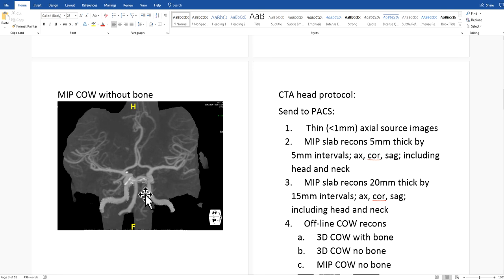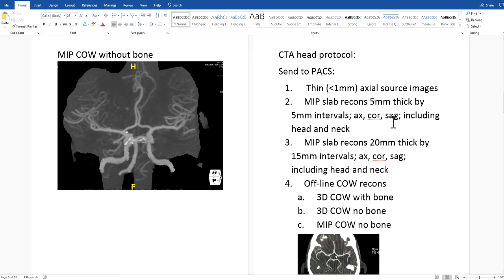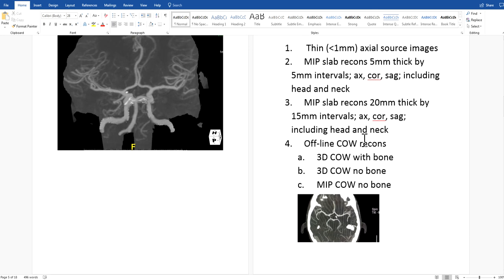We're really only talking in this video about how to make these offline COW recons. The whole CTA head protocol sent to PACS will have other information, including thin cuts less than 1mm axial source images, and then 5mm thick MIP slab reconstructions in 3 planes — axial, coronal, sagittal — including head and neck. We're also going to do 20mm thick slab MIP recons in 3 planes, and then we'll send our offline COW reconstructions.